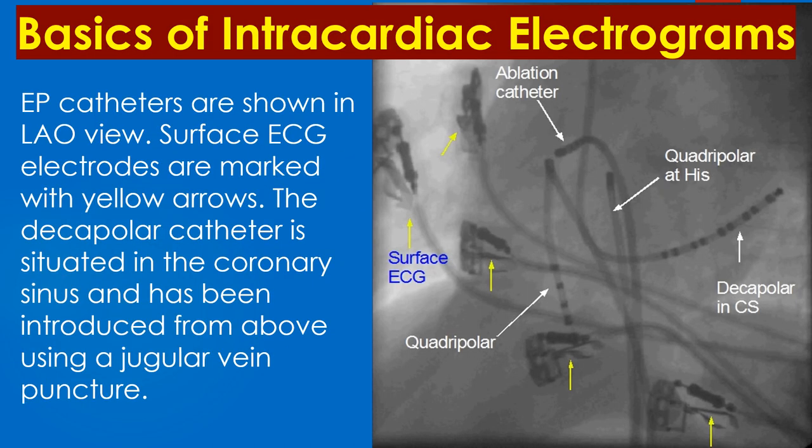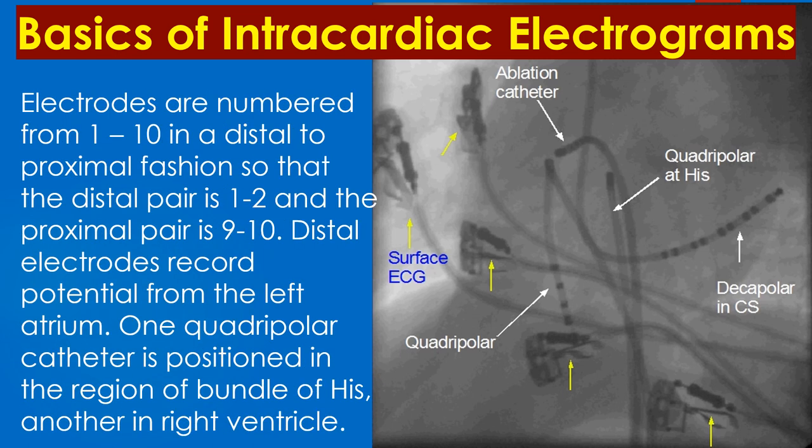Electrophysiology catheters are shown in the left anterior oblique view. The surface ECG electrodes are marked with yellow arrows. The decapolar catheter is situated in the coronary sinus and has been introduced from above using a jugular vein puncture. Electrodes are numbered from 1 to 10 in a distal to proximal fashion, so that the distal pair is 1,2 and the proximal pair is 9,10.